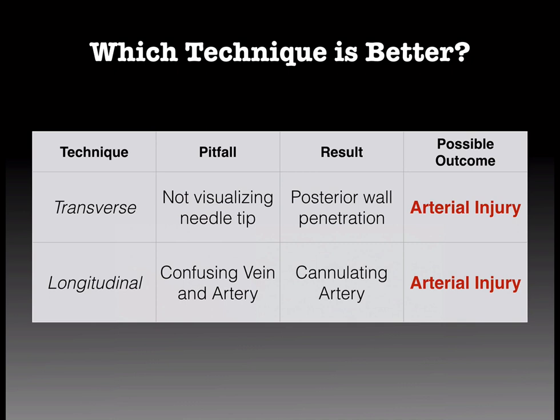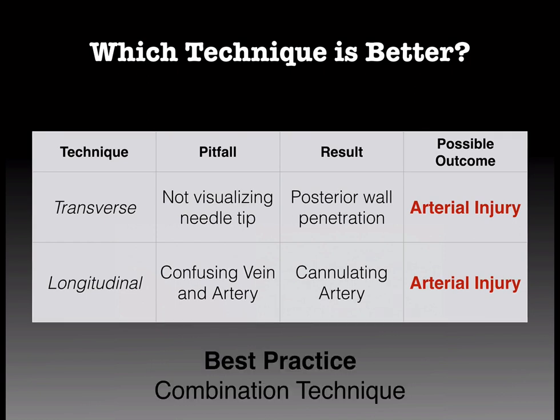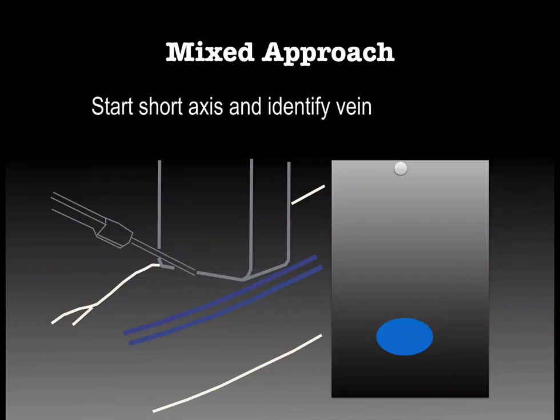The pitfall from doing the cross section or transverse is that you don't follow the needle tip down and your needle goes a lot further, maybe into the artery posterior. So the best technique is going to be a combination technique where you use the best of both of these techniques.